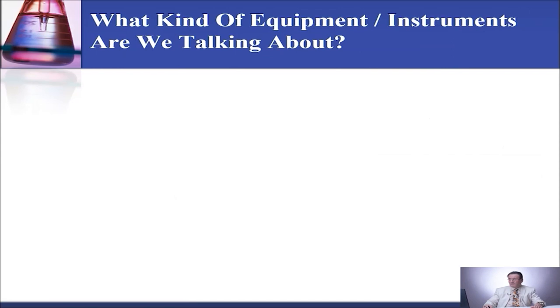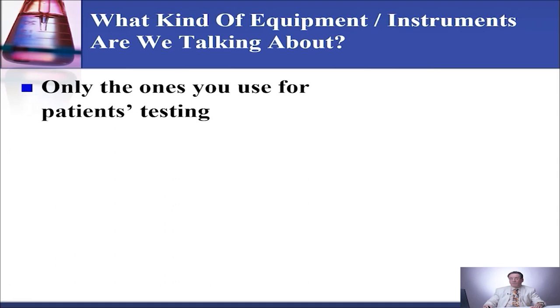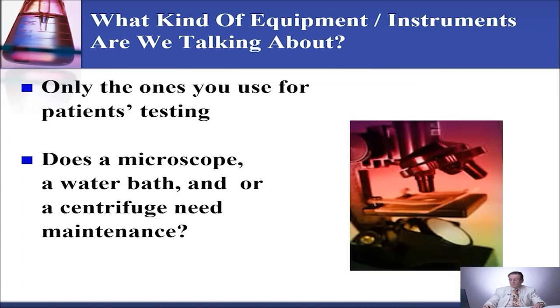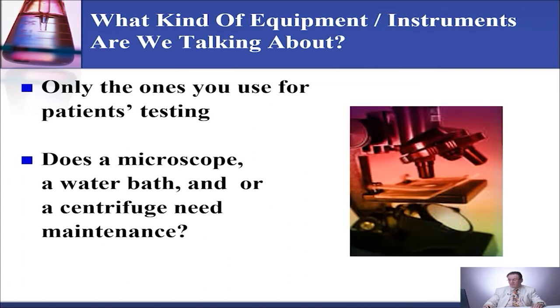So what kind of equipment or instrument are we talking about when we are talking about maintenance? Only the ones you are using for patient testing. So if an instrument is being validated or you are using it for research, you don't need to worry about recording the maintenance for that unless you want to. Does a microscope, a water bath, or centrifuge need maintenance? Yes, they do, if you are using them for patient testing.